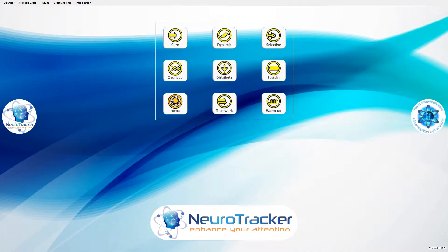This is a Neurotracker tutorial. In this video, you'll learn to add a user and start a core session.